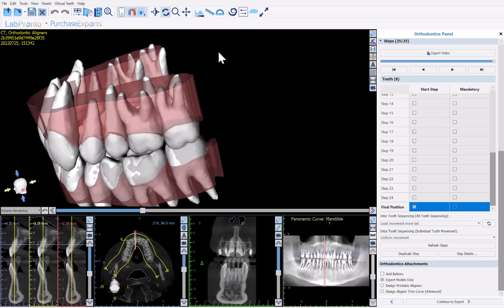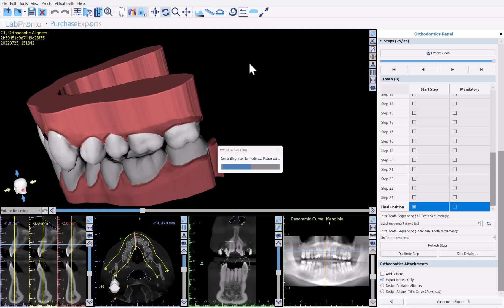We've completed our digital tooth setup and digital teeth movement. We may have added buttons to our case via the add buttons feature. Now we're going to continue to the export stage by clicking continue to export. The software is generating the relevant models for each step.